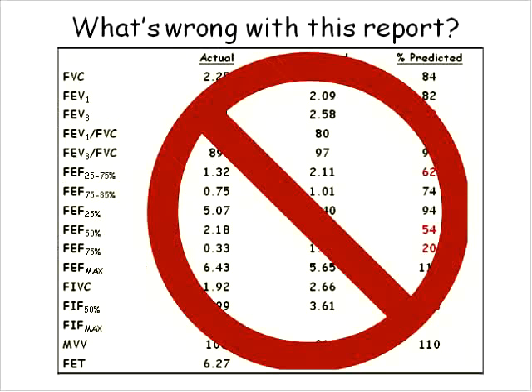Again, in many labs, this is the way the data is presented. Looking at the percent predicted gives us just a single number to try to help us make sense of the range of values. Whether or not a particular value falls above or below a real clinically important cutoff is not always exemplified by the percent of predicted.